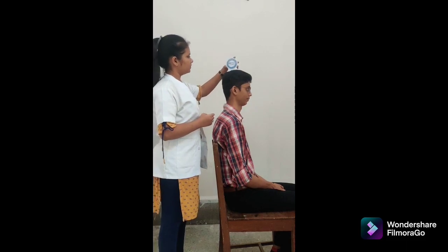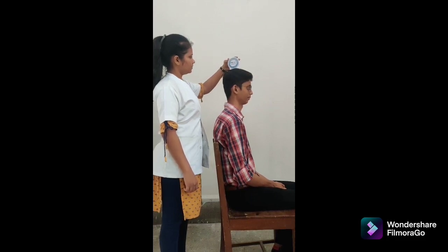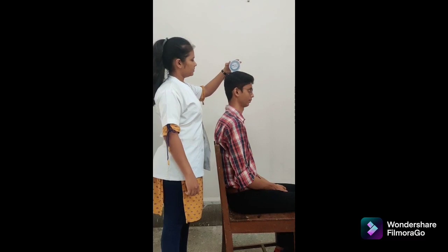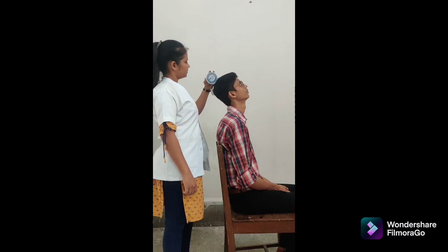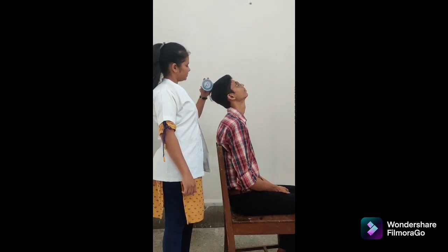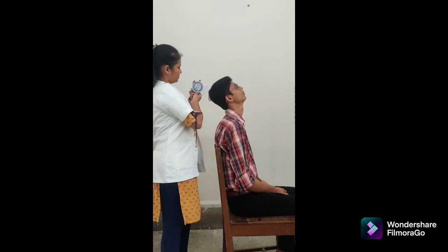We are going to perform cervical extension with inclinometer. Patient position: high seating with thoracic and lumbar spine supported by back of chair. Inclinometer alignment: place the inclinometer firmly on the top of the head, adjusted to 0 degrees. Instruction to the patient: raise chin first, then move the head backward as far as possible without moving the trunk. At the end of range of motion, read and record the degrees indicated by the fluid in the inclinometer.